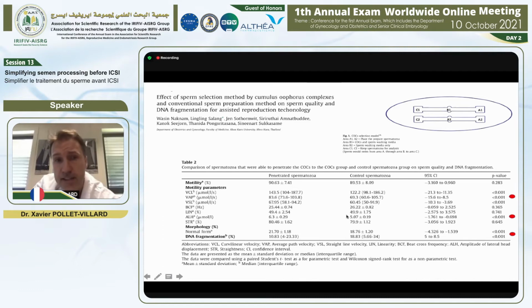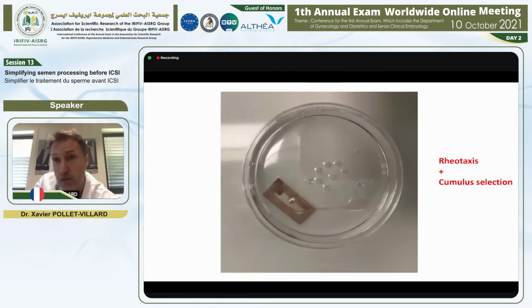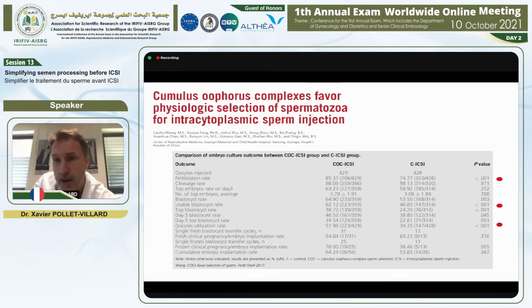And you can see that there is an improvement in motility parameters, especially velocity and ALH, but also in the normal forms and the DNA fragmentation incidence in the spermatozoa. So it seems that going through the cumulus complex is improving spermatozoa quality. But what about clinical results? Well, I will present that after.